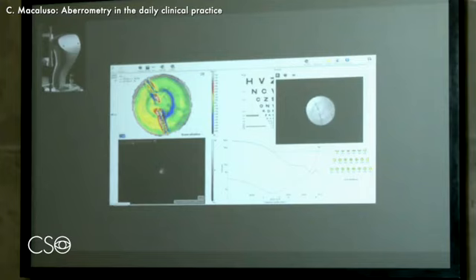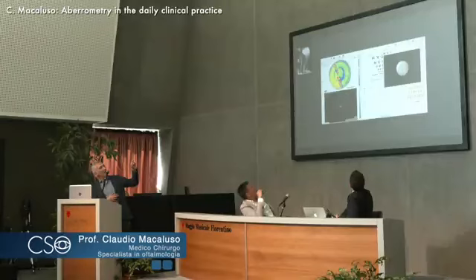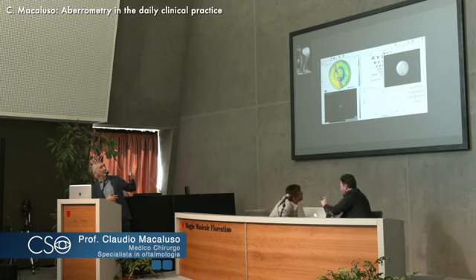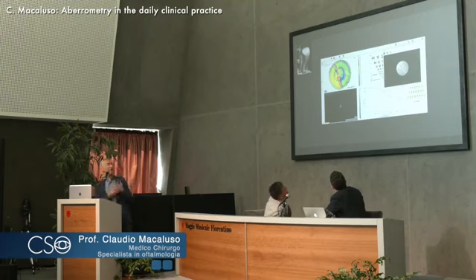And we see on the right panel, I think you can appreciate the retroillumination picture, the IOL in there as something strange, that is a Vivity, an Alcon Vivity IOL, so it has different concentric refractive areas. But also we can see this opaque line, those are little faults in the capsule. They are not a major issue.